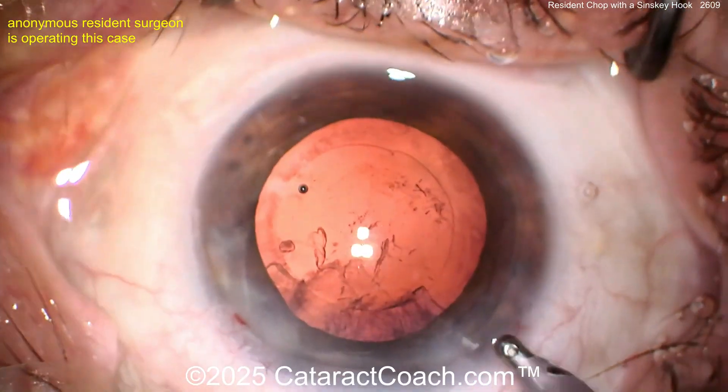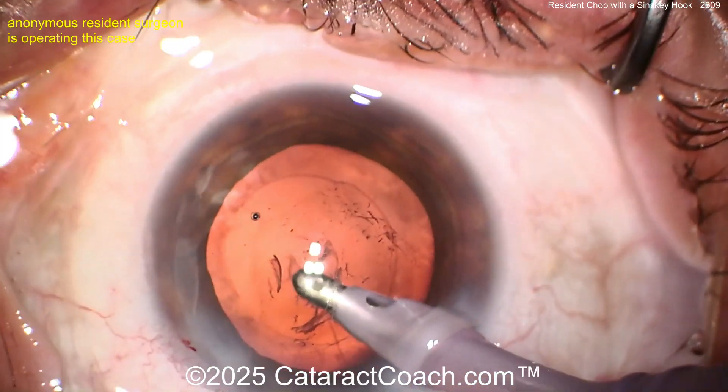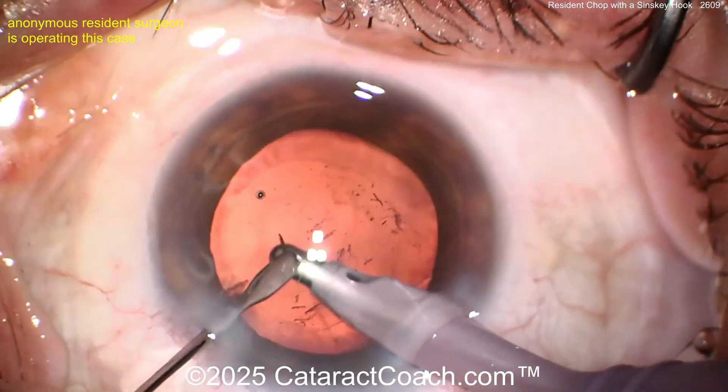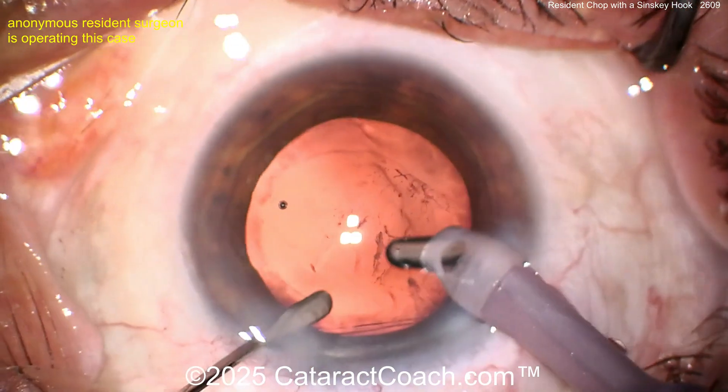That just proves that ophthalmology is about lifelong learning. Now cleaning up the cortex — not a whole lot of cortical material. By the way, nice-looking rhexis — I like that. Beautifully done. Clean this up and we'll finish the case. I think you're doing a great job.